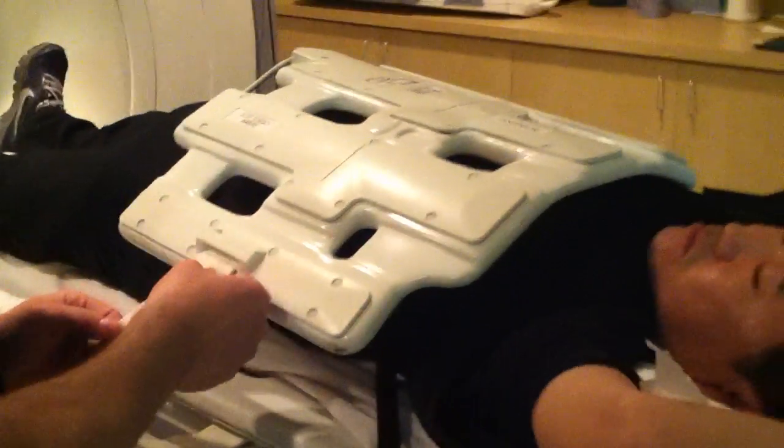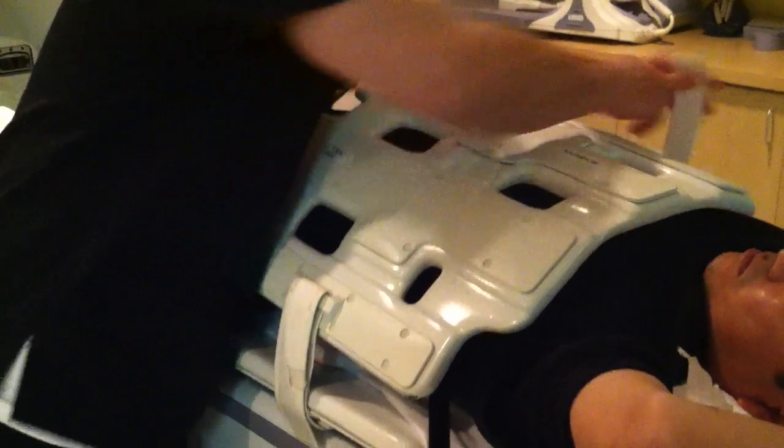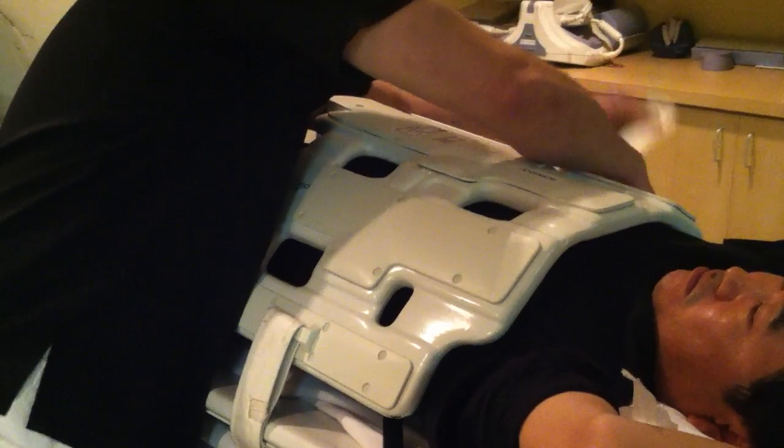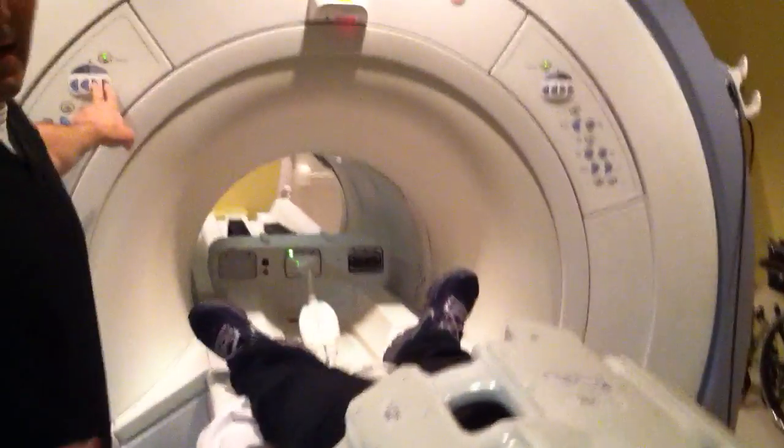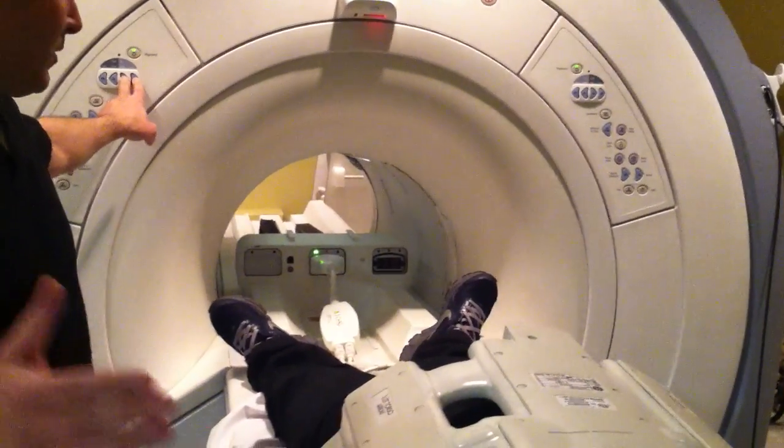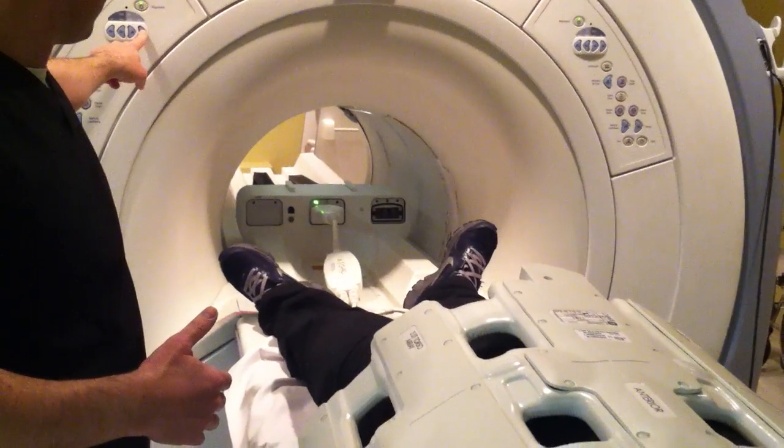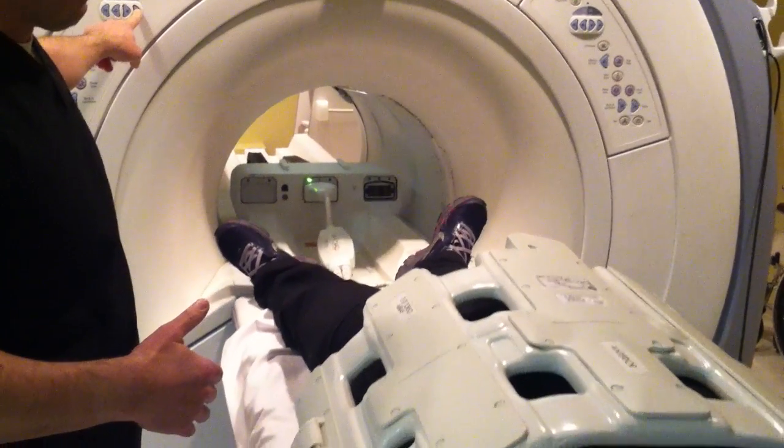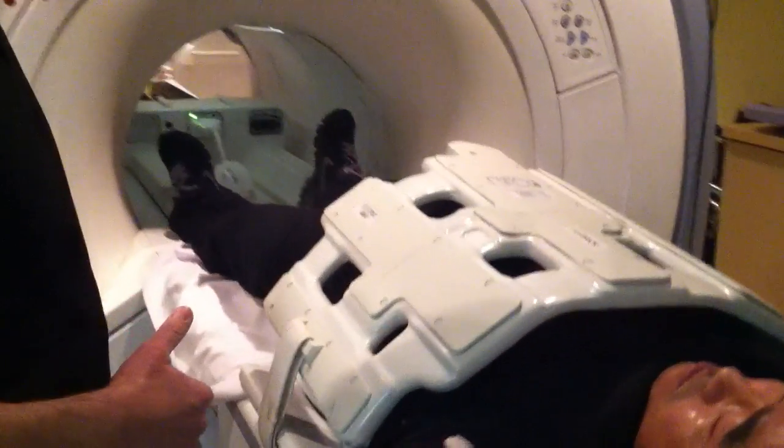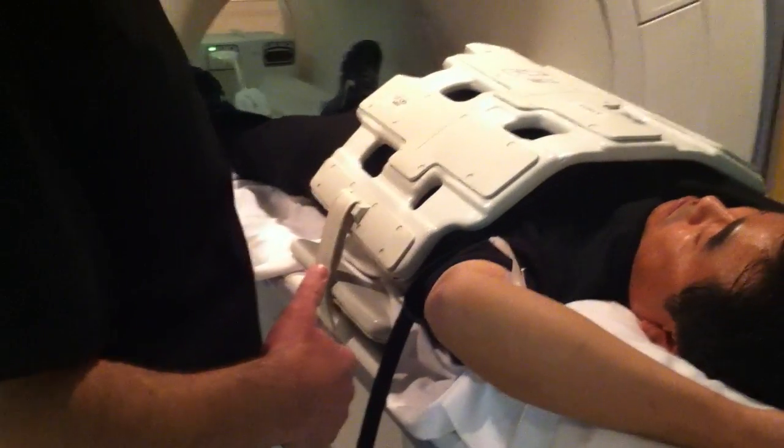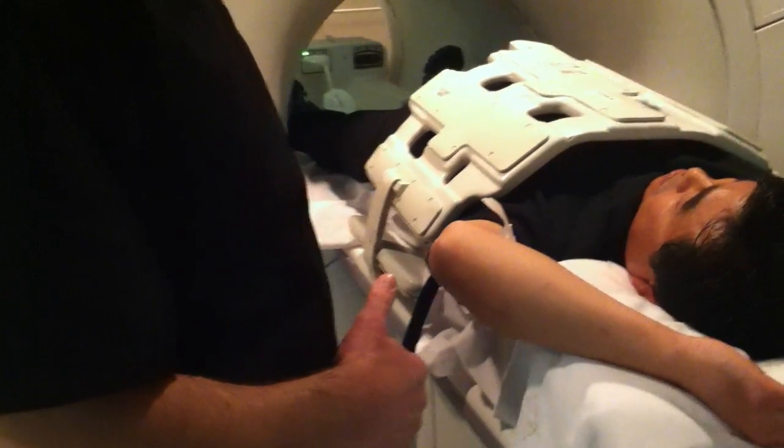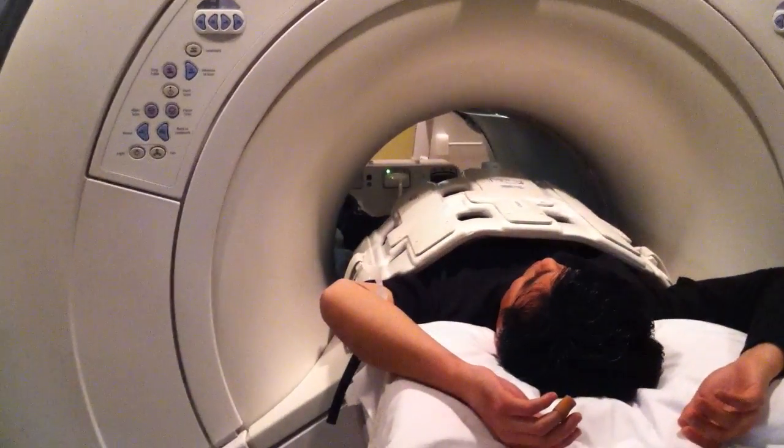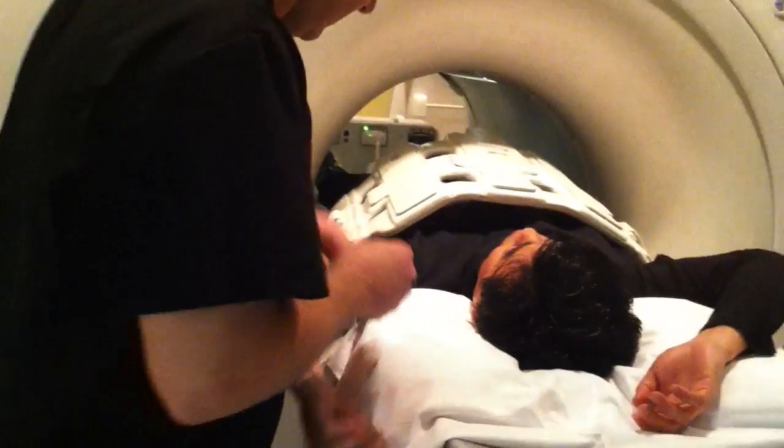Once you get your coil set up, notice I have not attached the IV line yet because he's too far out right now. So we're going to bring him in. We're looking about this far. Now, we're going to attach our IV line. Again, making sure there's no air in the tubing. We're going to attach it like so.